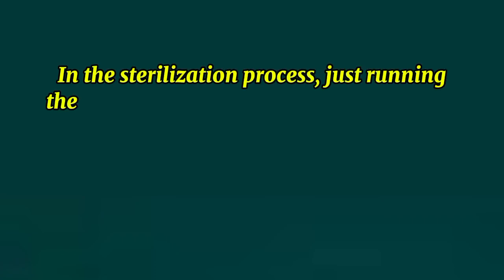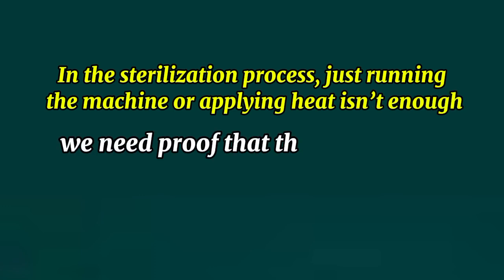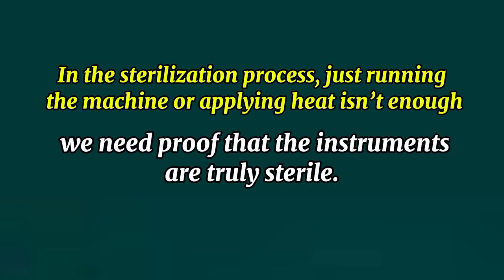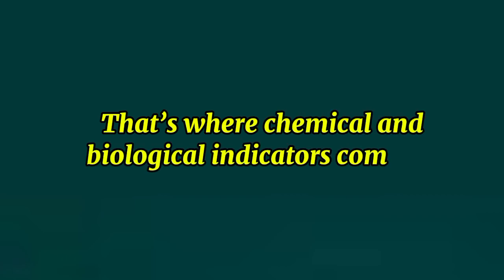In the sterilization process, just running the machine or applying heat is not enough. We need proof that the instruments are truly sterile. That's where chemical and biological indicators come in.